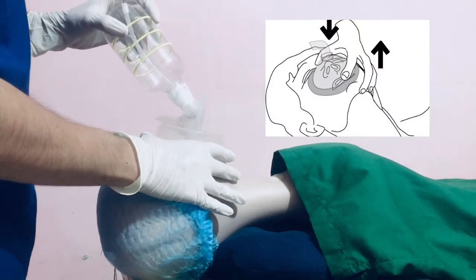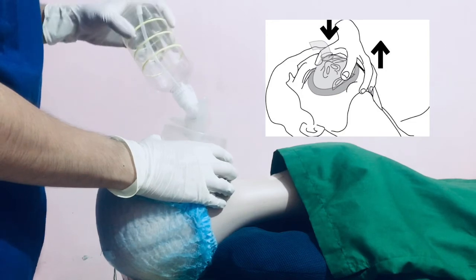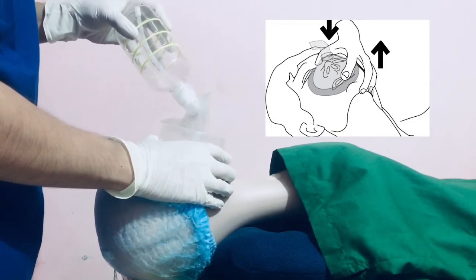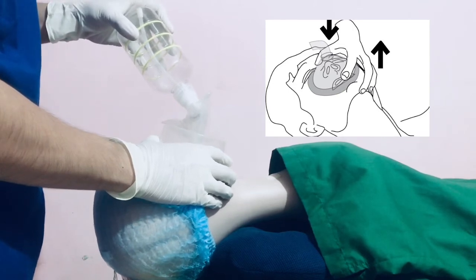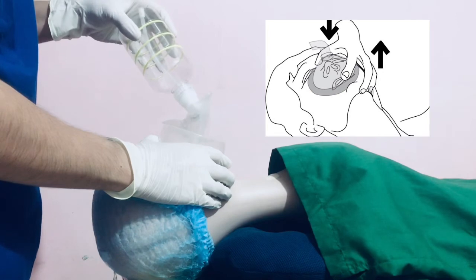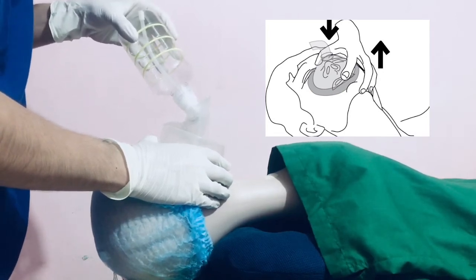Pre-oxygenate the patient with 100% O2 for 3 to 5 minutes to allow for O2 reserve. A bag valve mask attached to an O2 source with an airtight seal is used. Hold the mask using the thumb and the index finger, forming a C grip around the mask, pushing it down, and the other 3 fingers under the mandible, pushing it up.